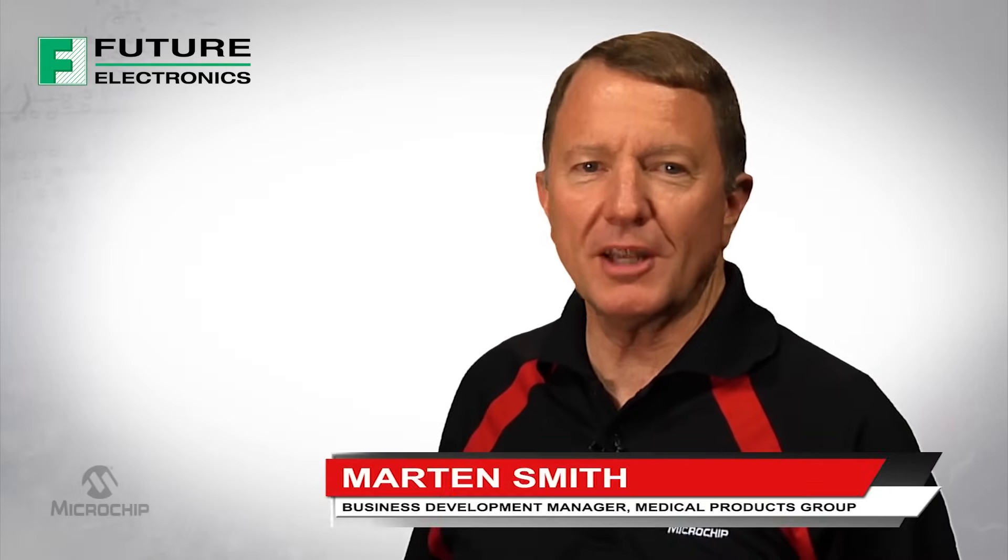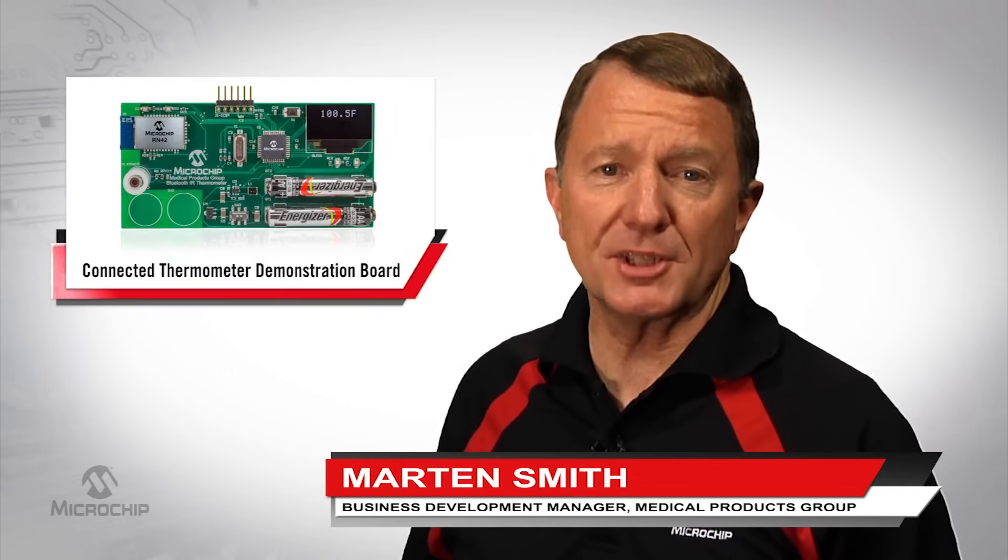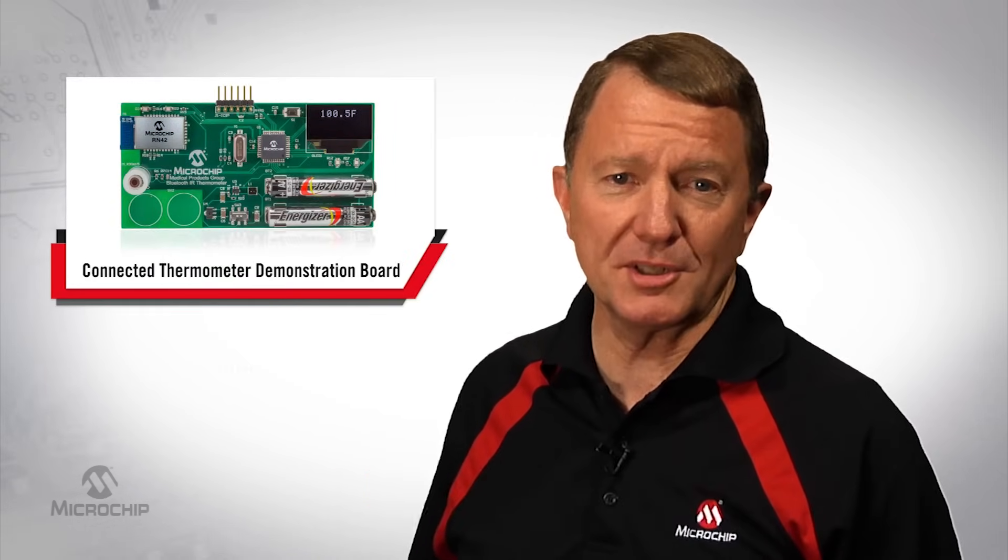Hi, I'm Martin Smith, Business Development Manager for Microchip Technologies Medical Products Group. Today I'd like to show you Microchip's connected thermometer demonstration board.